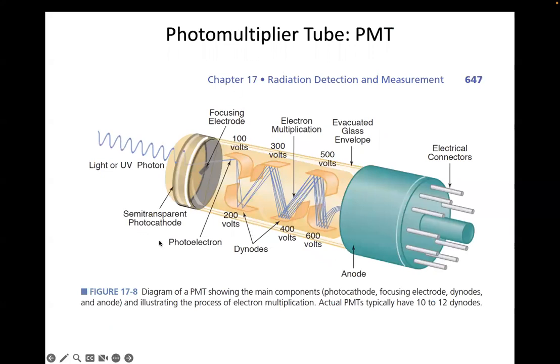This is a really interesting analog device, which changes basically a detection of a gamma ray by a flash in a material like a sodium iodide crystal or something like that. So you get a flash of light.